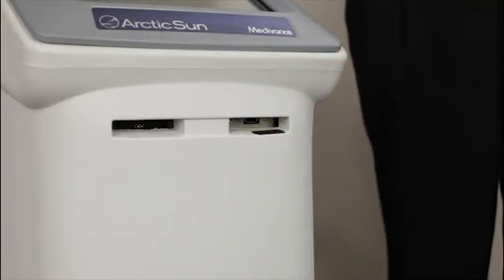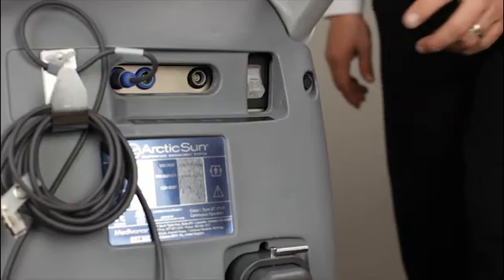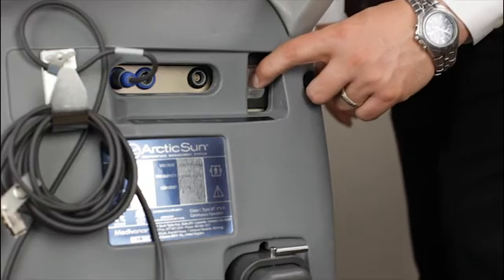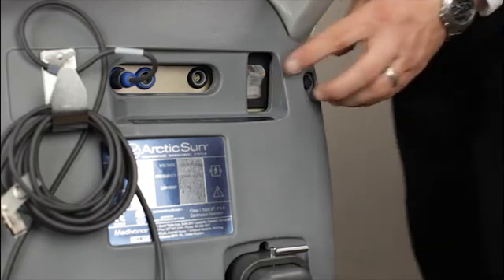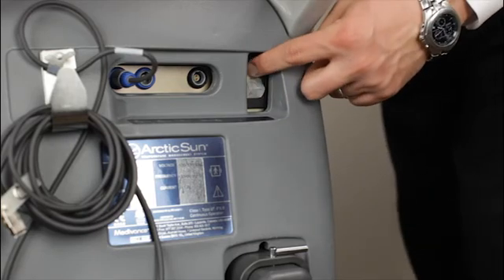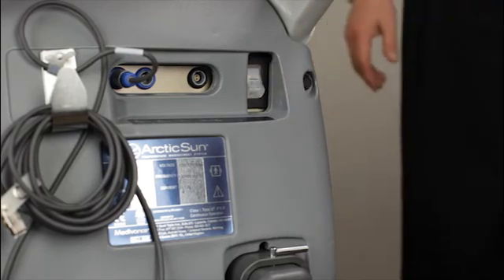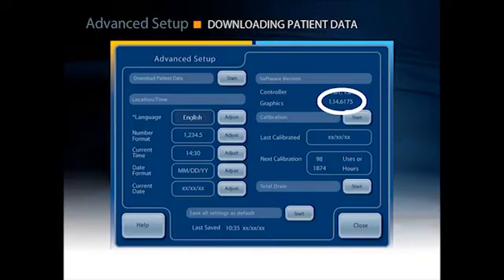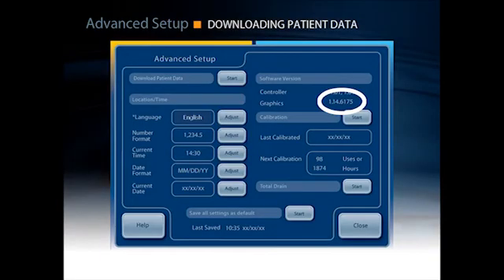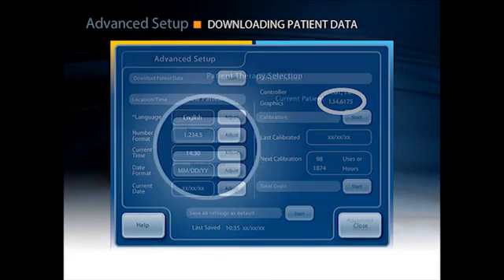Remove the USB and cycle the power. Verify that the Arctic Sun 5000 temperature management system powers up normally. Re-enter the advanced setup screen to verify the graphic software version is 1.14, followed by a 3 to 5 digit number that is unique to each control panel.